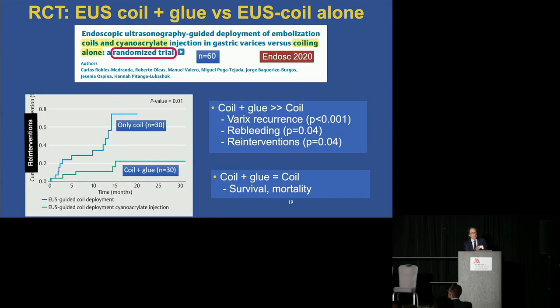And then we have this study showing that a combination of coil and glue is superior to just putting the coil. So the glue does add something to just the coils. And there are some that just use coils, but you really have to pack them in.